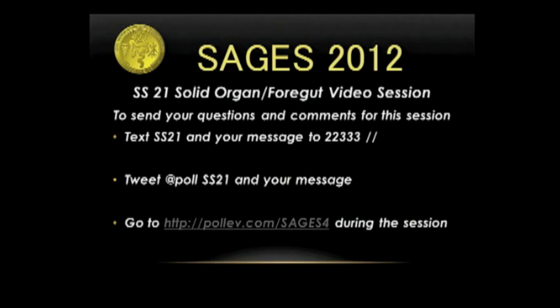Video is open for discussion. We have quite a few text questions. Why don't we start with right in the aisle? I think excellent video, great dissection, but was there any consideration made of just either tying the vessel or stapling it on both sides and leaving the spleen in place in a lady who's pregnant and you want to get out fast?